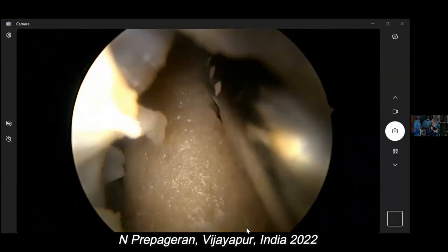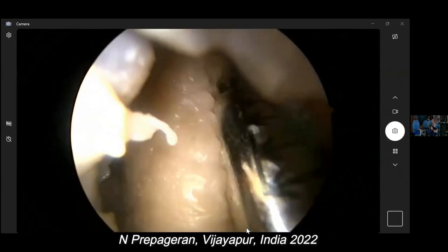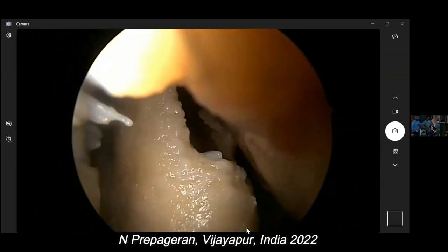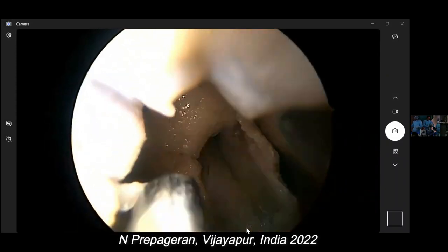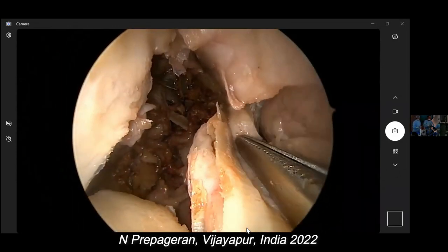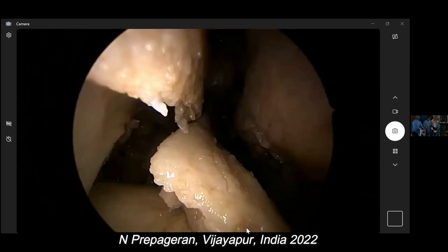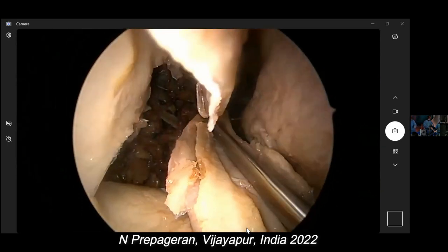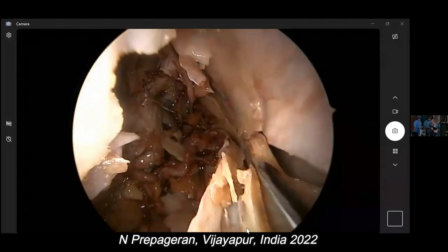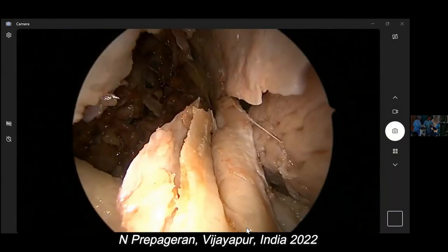Okay, guys? Okay, let's cut this flap. You're not audible, sir. So what are you doing? Mm-hmm. Yeah, I feel it. Is it the rostrum, sir? Yeah.